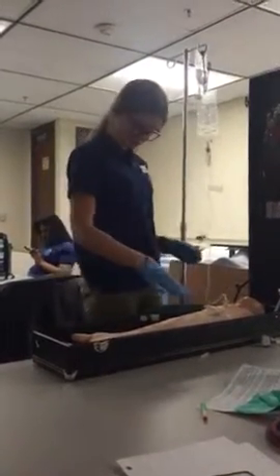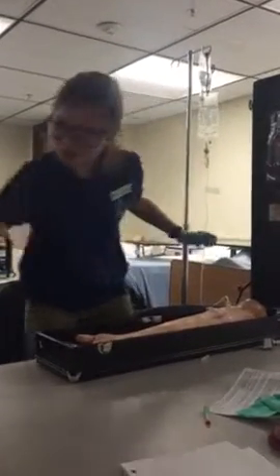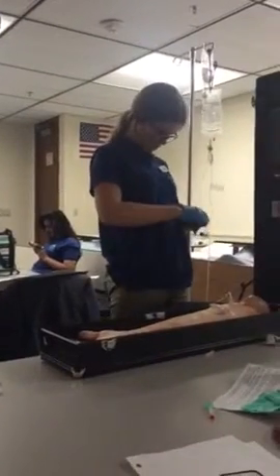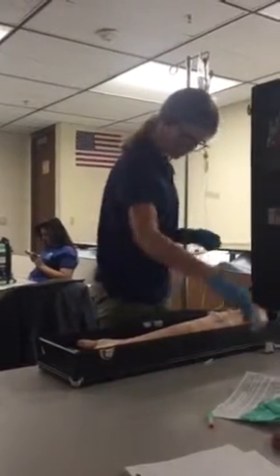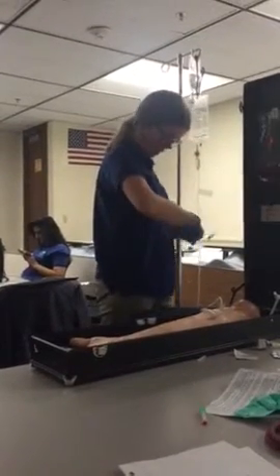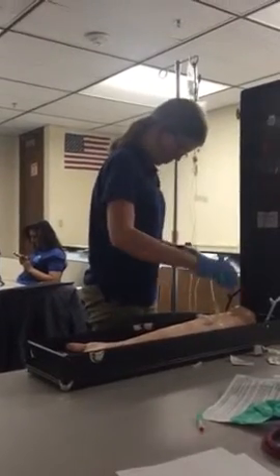Okay, and since this IV is already attached to the primary line, but first I'm going to apply the tourniquet. Clean the port. Apply your alligator clamp. Clean the port. And attach this.